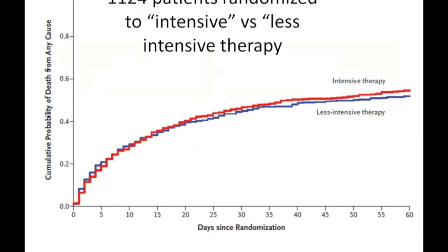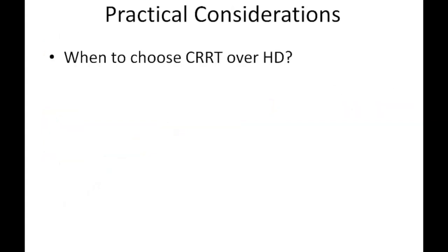And so, that is good news for us because these dialysis fluid bags may be in short supply during a COVID surge, and so we're generally not compelled to do more intensive CRRT except for some very specific indications like hyperkalemia that needs quick correction.